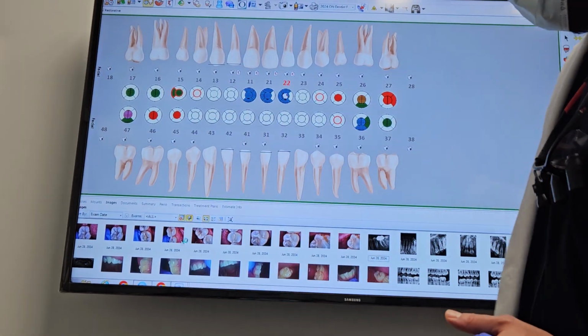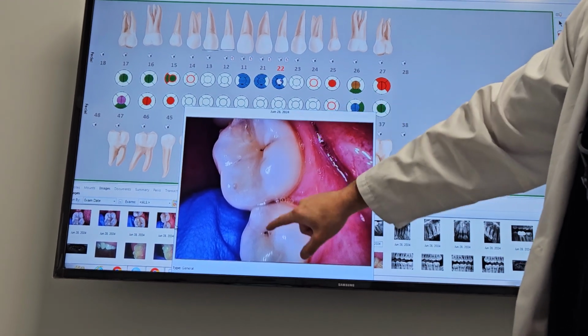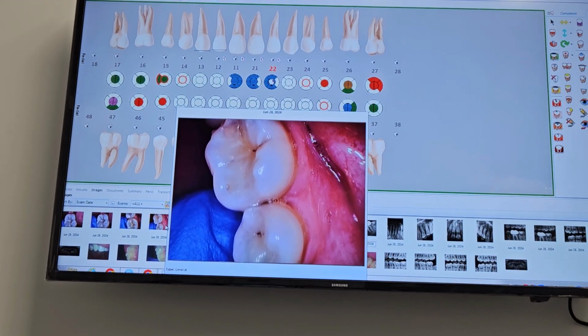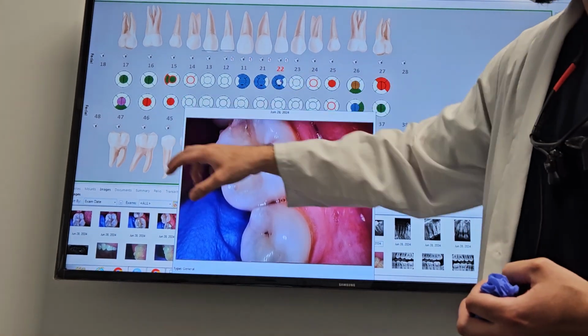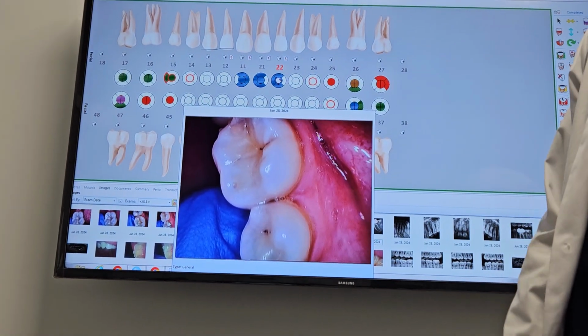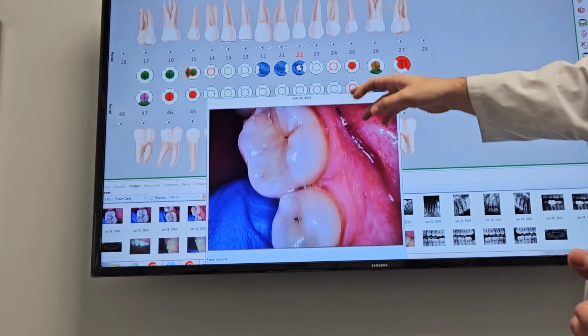Then I'm going to show you the bottom right, a little bit larger. Right over here, you see all these black things, and that's what I'm saying. The clenching is contributing to it, and you do have old fillings in these teeth. They're not charted because I think these fillings were done at 415 at the other location. So they're not on the chart. This should actually look like this. But it's all good.